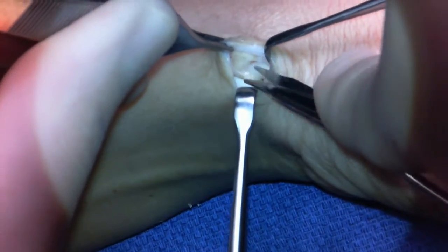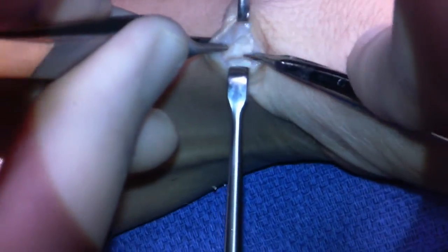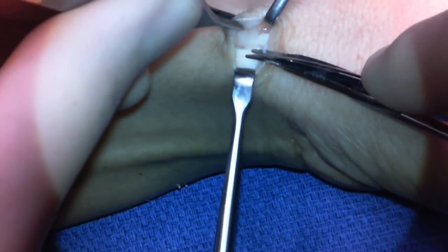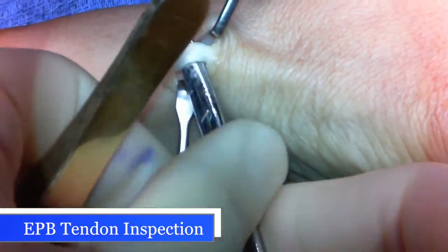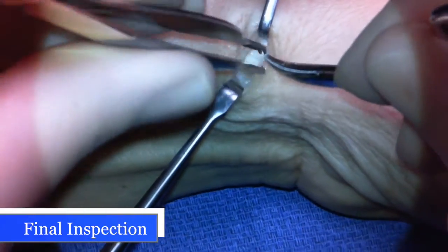I'm opening the additional compartment. Now you can see the EPB tendon — a rather robust tendon — extending the knuckle or the MCP joint of the thumb, now signifying a satisfactory release.